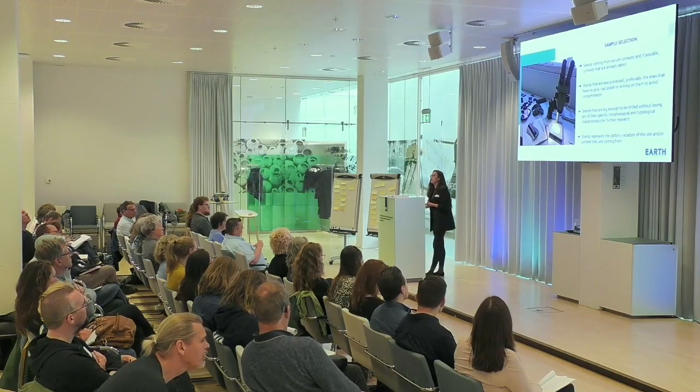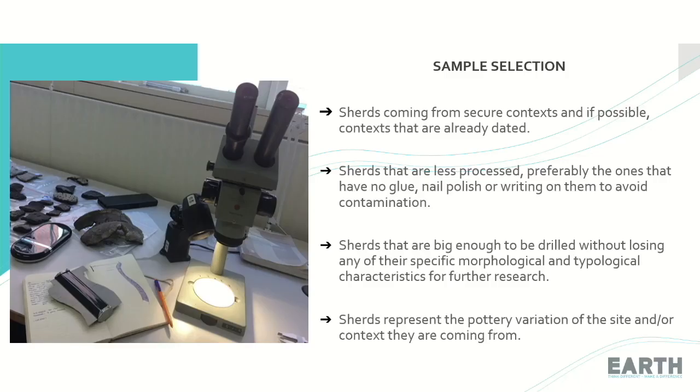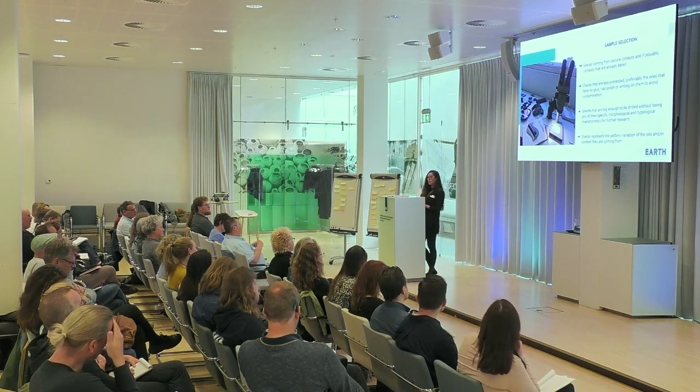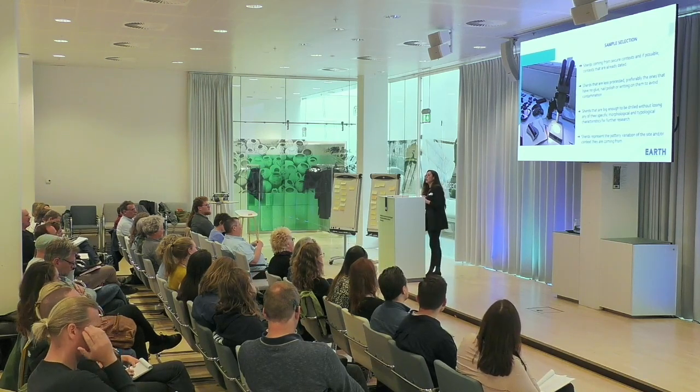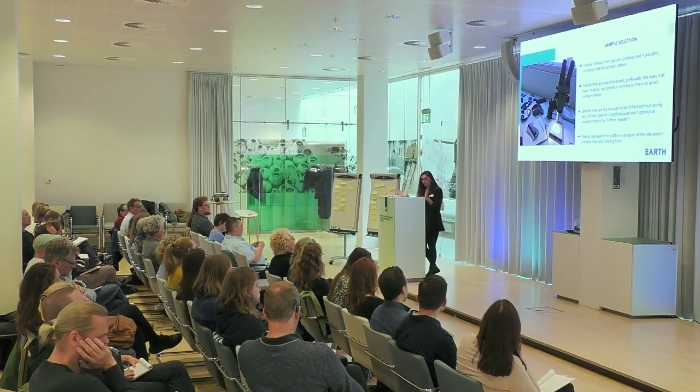And the third one is that shards are big enough to be drilled without losing their specific morphological and typological characteristics for future research. This is also not always possible. There were times that I had to crush the whole sample just to get enough material to be analyzed, but I can only do that in a secure context, where I know more material is there.